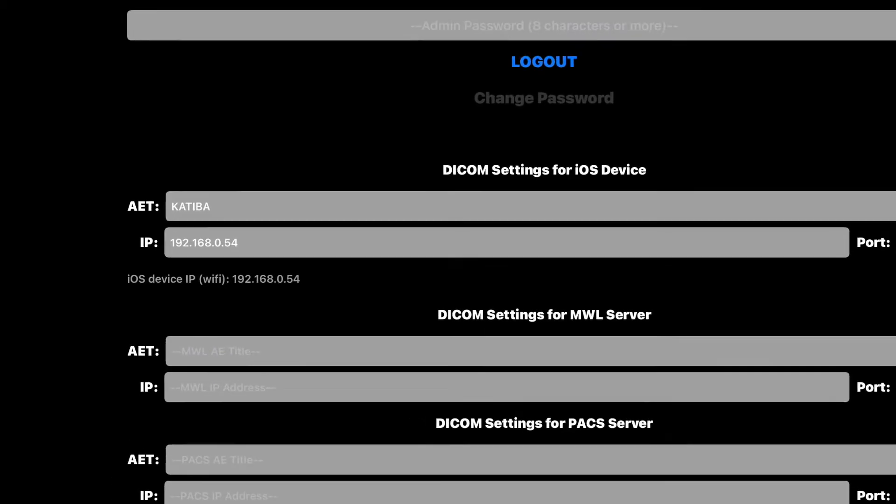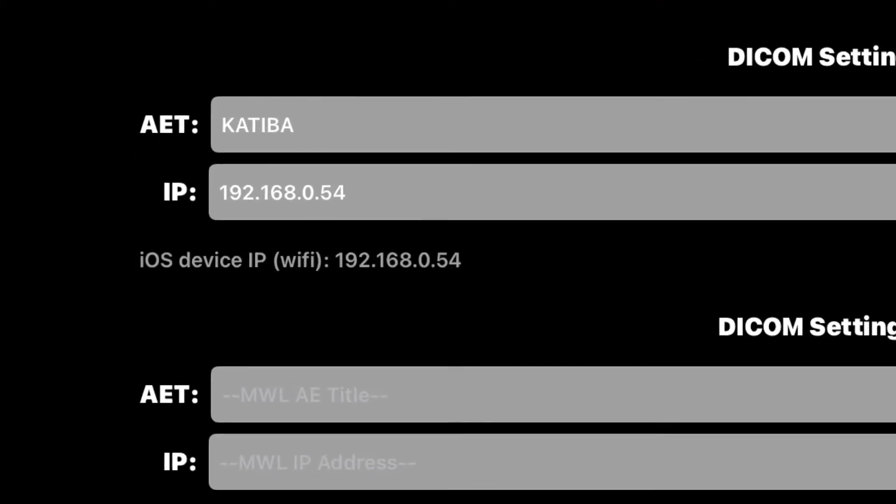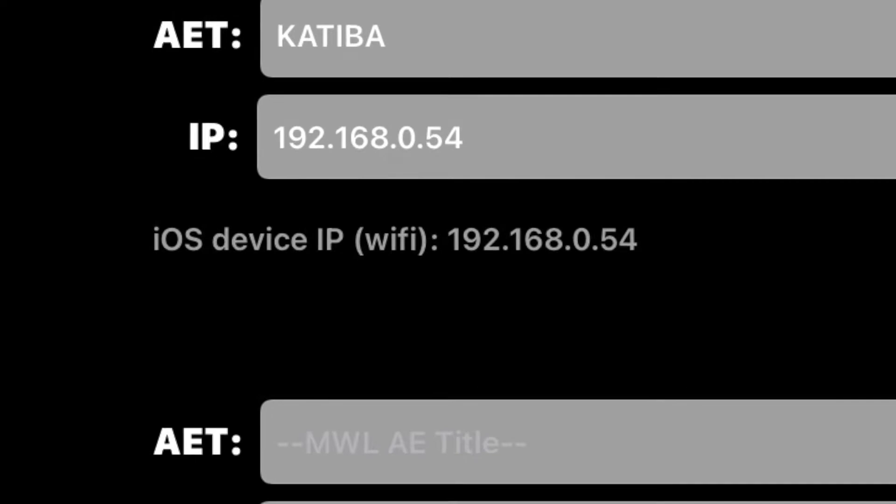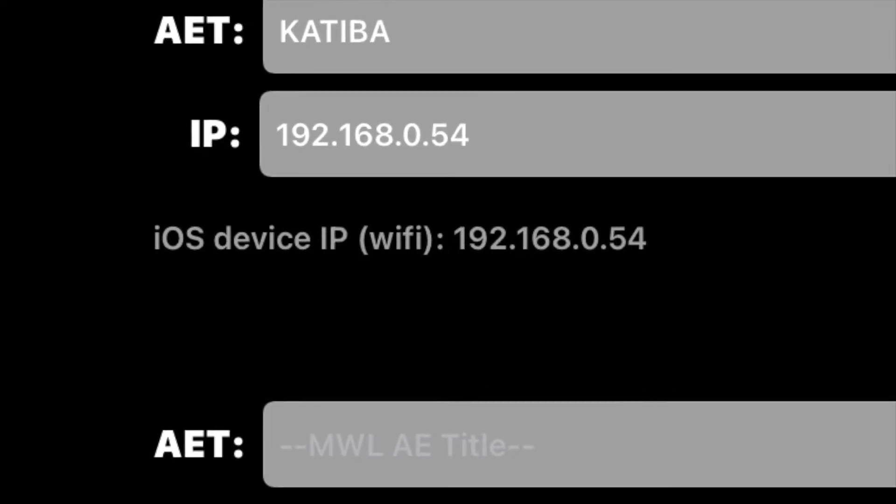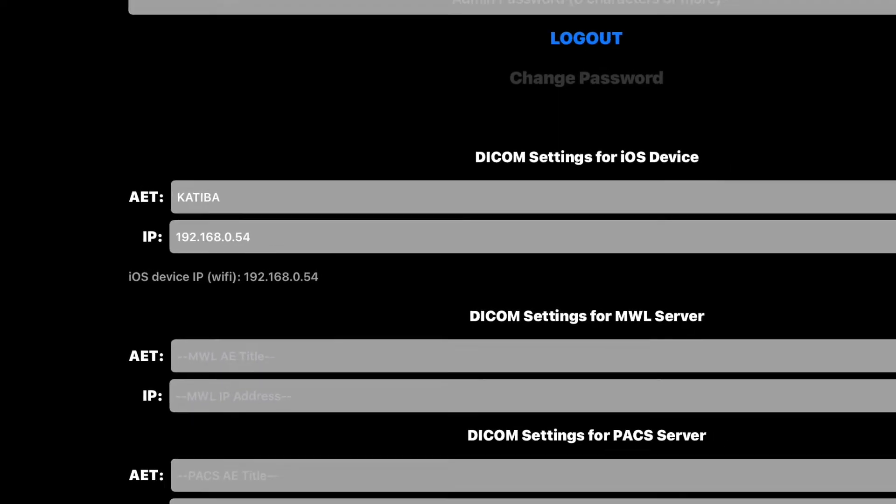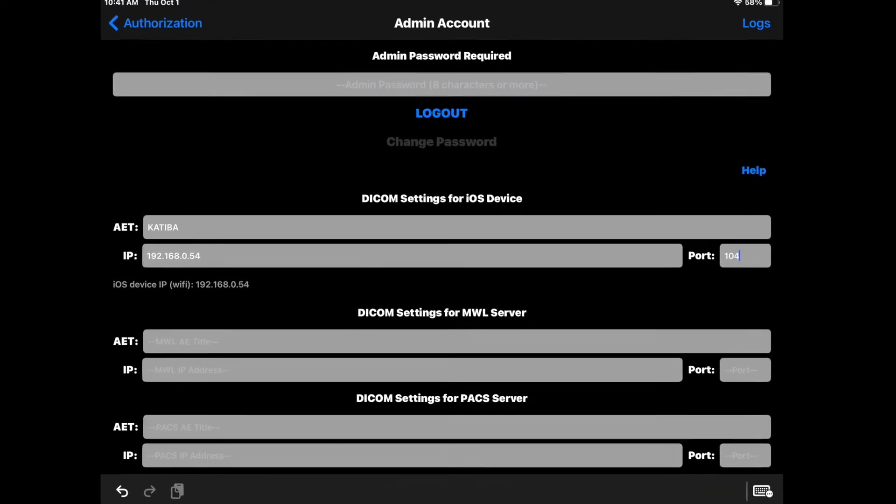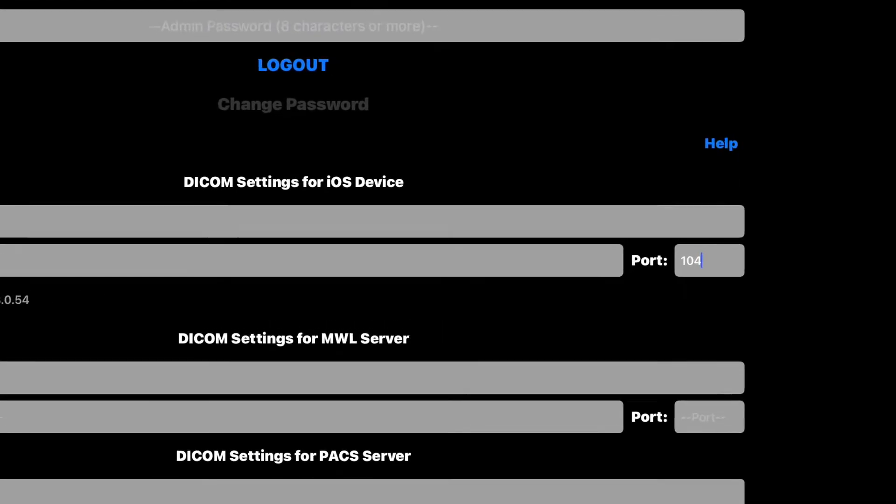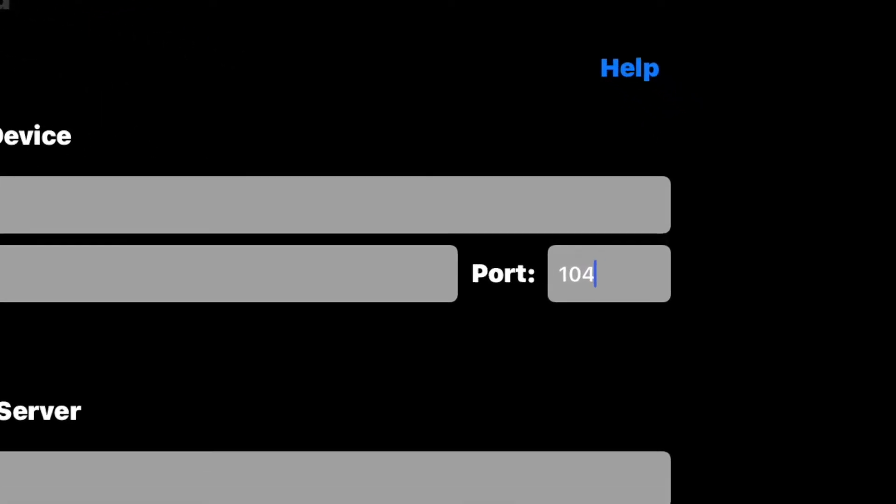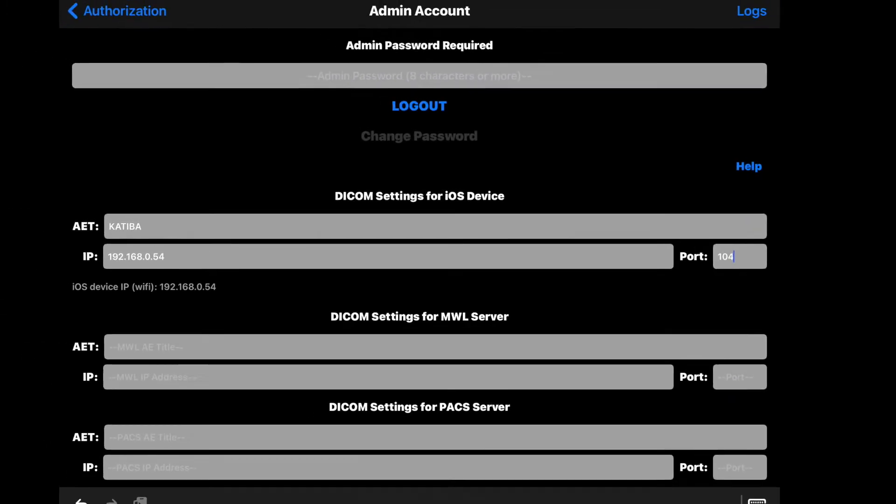Enter the IP address of your iOS device. If you are connected to Wi-Fi or Ethernet network, your IP address will be shown by the app. Enter the listening port number. Most DICOM servers use 104.